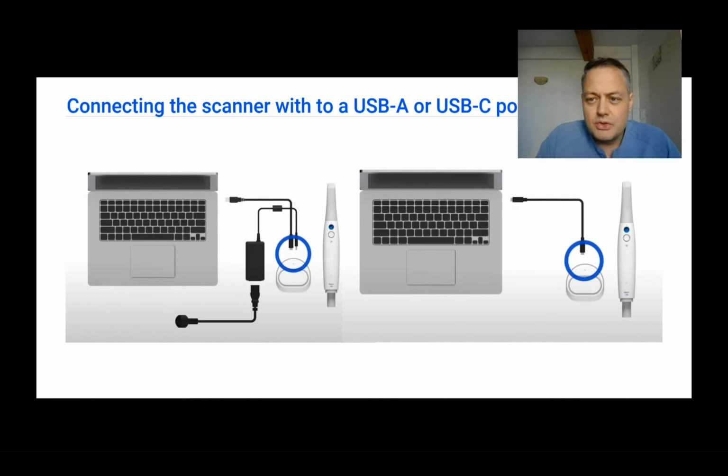So if you are going to use a laptop with only USB-A 3.0, you will also need to plug the scanner or the base into a wall socket, because power is going to come from the socket and information is going to flow through the USB-A cable.